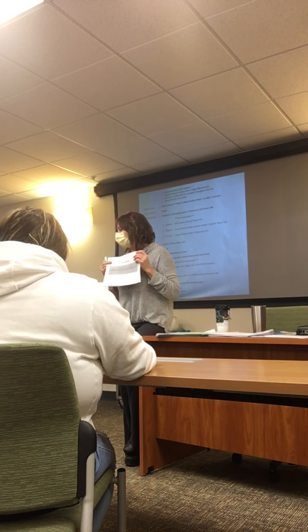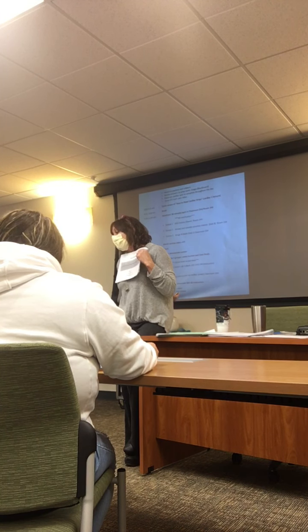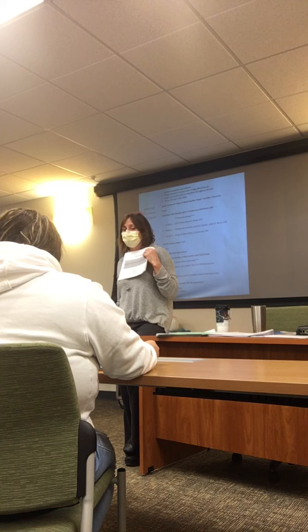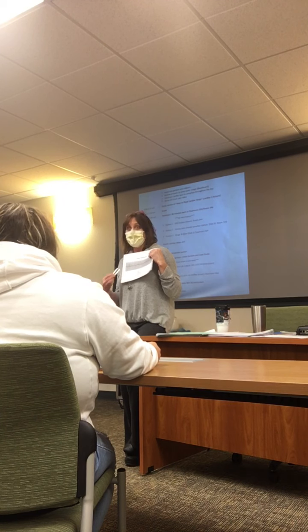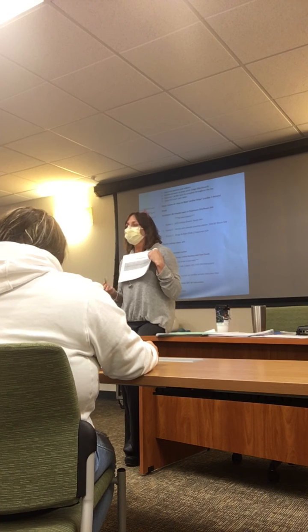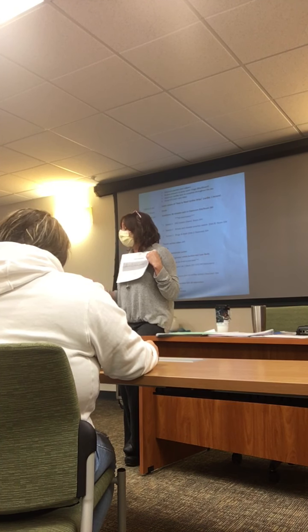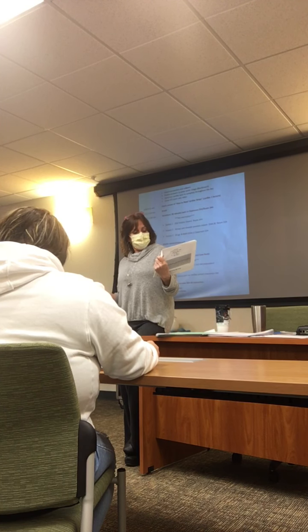How do I know what the rate is? The R waves, right? I can't really tell an atrial rate because it's so fast. I think your textbook says 200 to 600. But I'm not going to make you do that. Just the ventricular rate. What are you getting for a ventricular rate? 70. So is that within normal limits? Yeah. So the rate is 70.